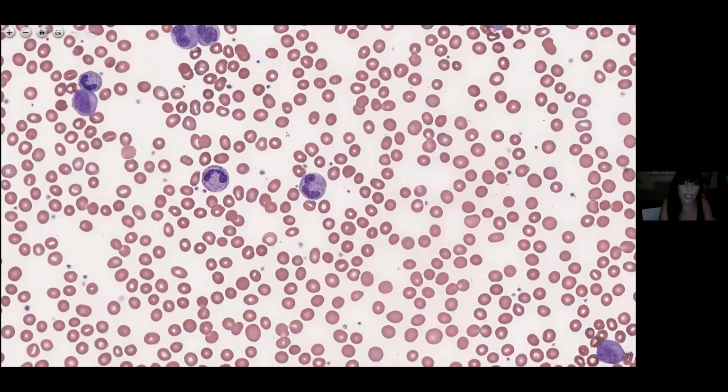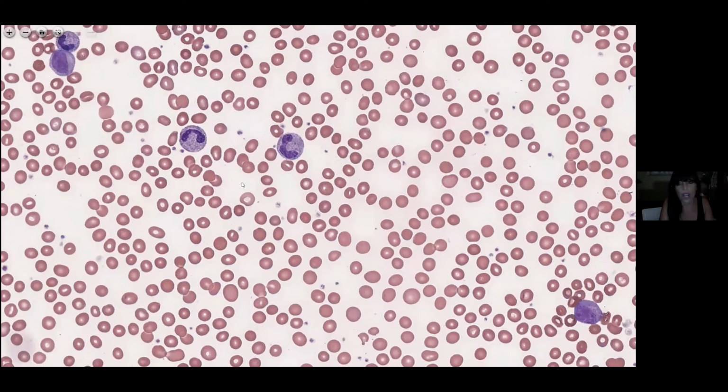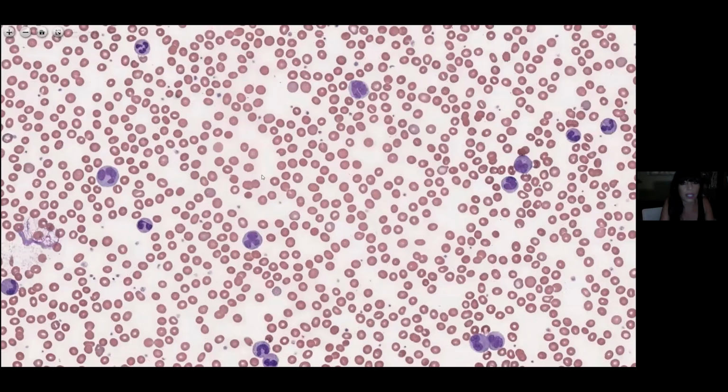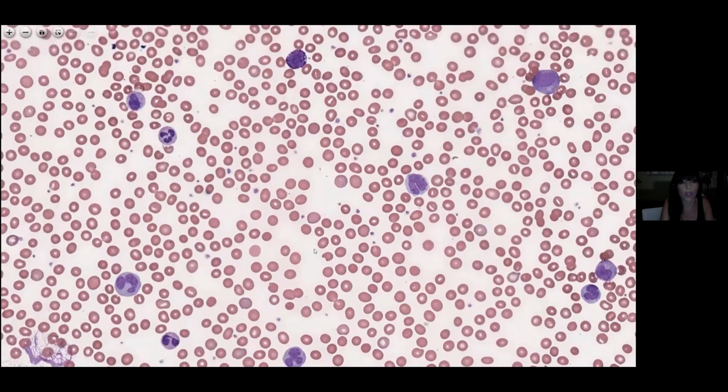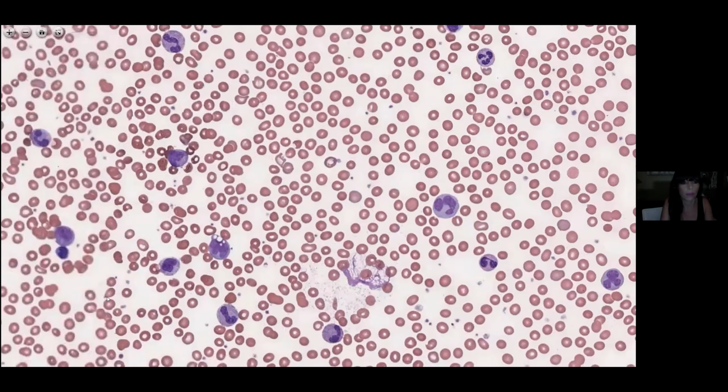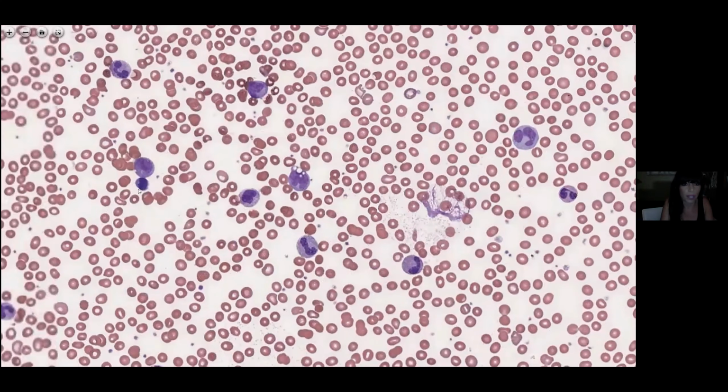For the RBCs of this case, we again want to try to find a lymph for reference for the general size of the RBCs. And the central pallor should be about 1/3 of the cell, at the center. Here's a nice lymph here we can use for reference, and look at its nucleus for the RBC size.